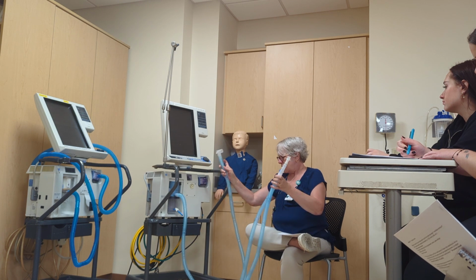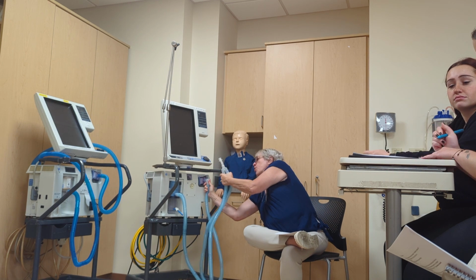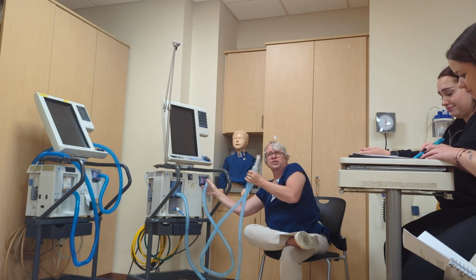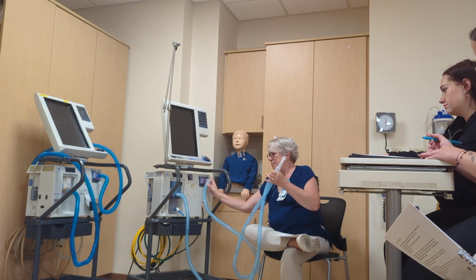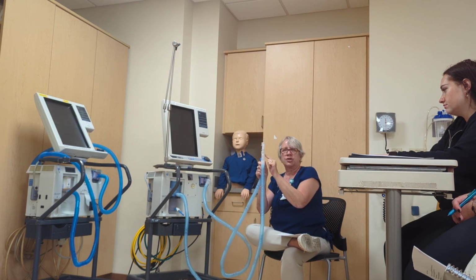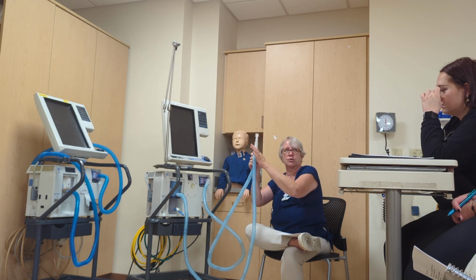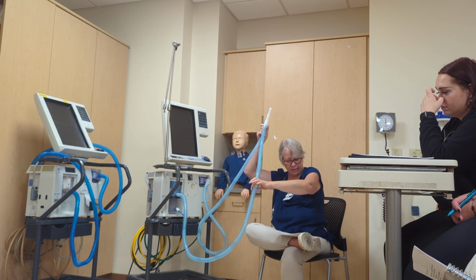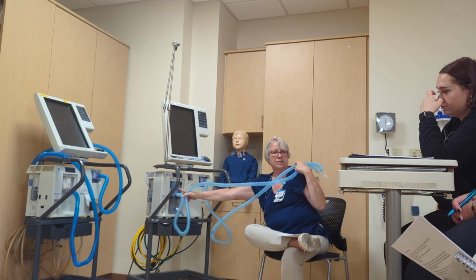So gas goes from the ventilator through the inspiratory filter, which filters out dust, bacteria, particles, anything like that. Through the large bore tubing on the inspiratory side to the Y connector, which separates inspiratory from expiratory. So inspiratory side to the patient breathes in. When the patient breathes out, the gas flows through the expiratory line, the expiratory side, okay? And then it goes out to the expiratory filter, okay?